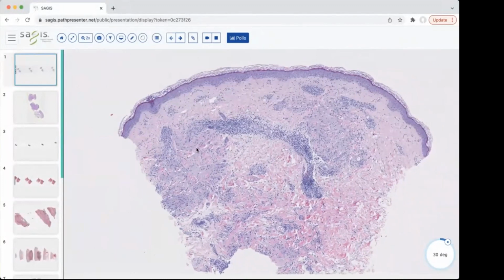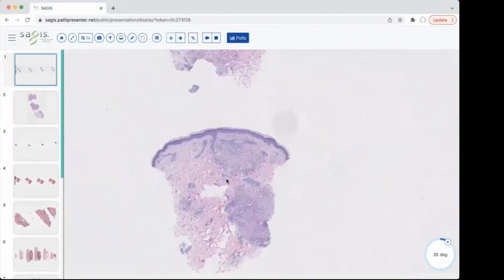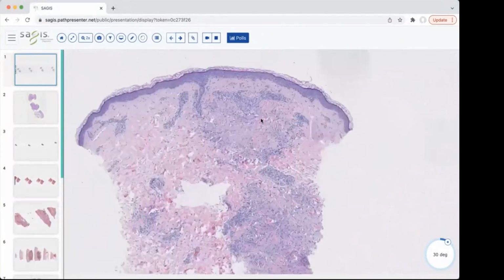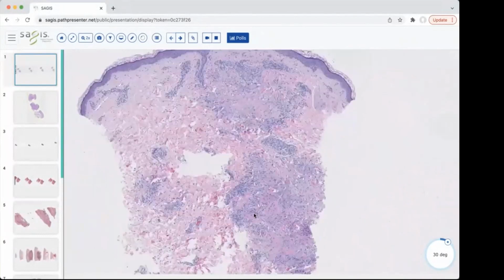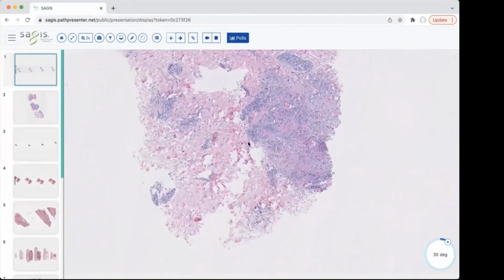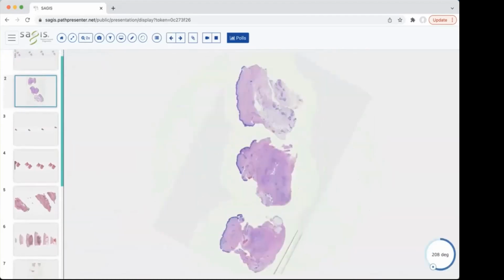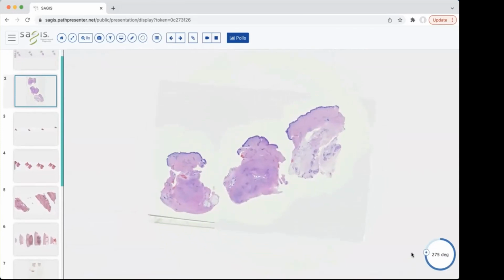And I think that one is easier to see on the low power. We can look at this second cut here and notice that here there's that sort of rim again of histiocytes and blue in the center. It's superficial and deep. Lots of granuloma annulare will be like that. There's a deeper form that can be sort of at the deep dermis and subcutis as well. Okay, on to the next slide. Try to get this turned the right way for you.